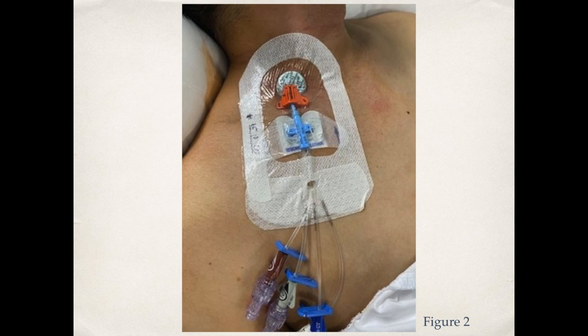So this is an example of a CVAD which is interjugular, so it's going into the jugular vein. You can get them subclavicular, and you can also get femoral or PICC lines, which are peripherally inserted. So this here on the end of the lumen is called a bung, or a needleless connector. And this is a little impregnated sponge with chlorhexidine, and that just stops any infections. And this is a stat lock, so that's a securement device, which you may see on certain CVADs, but not all of them.